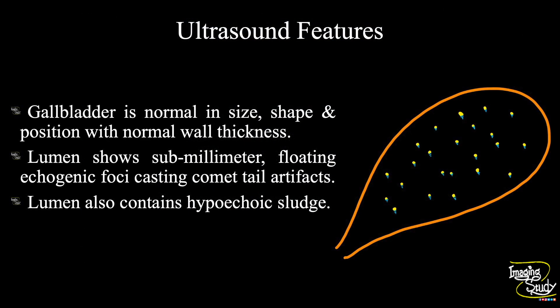So in summary, the gallbladder is normal in size, shape, and position with normal wall thickness. The lumen shows sub-millimeter floating echogenic foci casting comet tail artifacts, indicating cholesterol floaters. Hypoechoic sludge is also seen within the lumen.